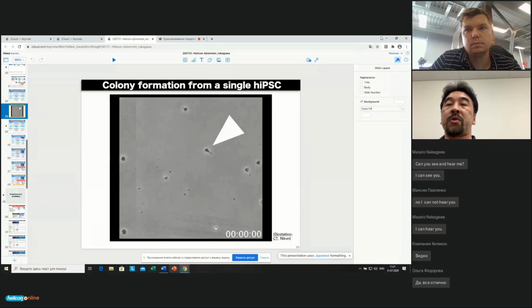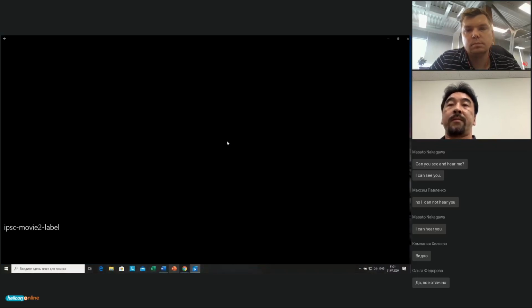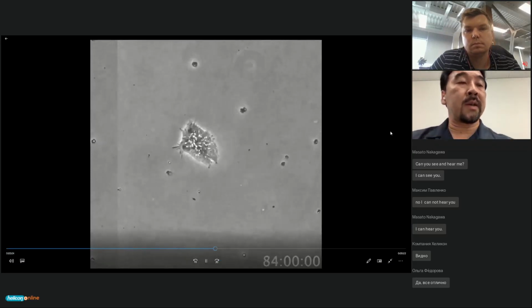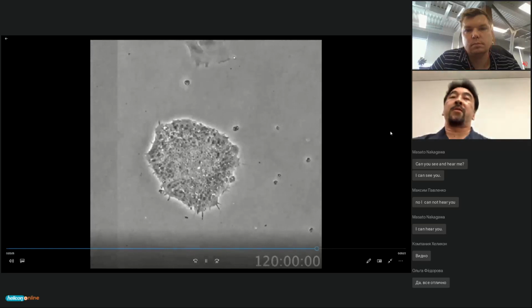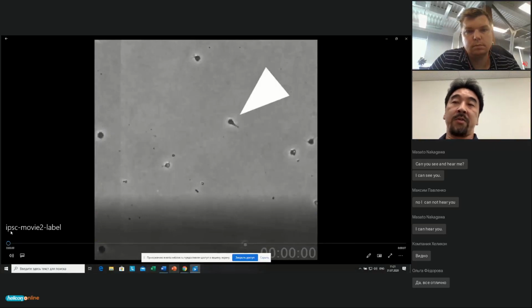Could you show the movie? Thank you. So this is a time-lapse image. At first, you can see the single iPS cells indicated by arrowheads. Please start.